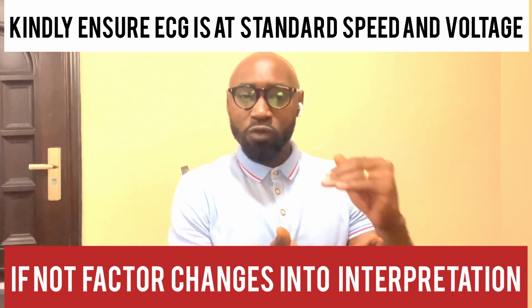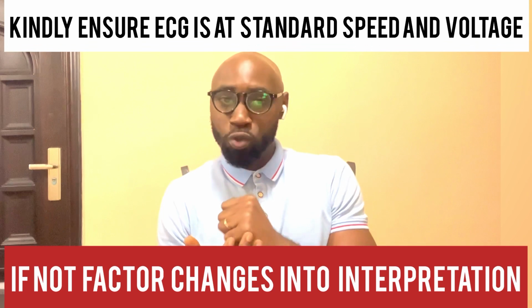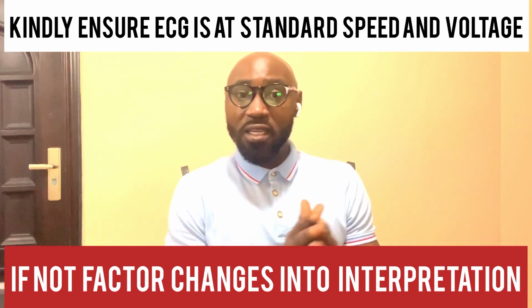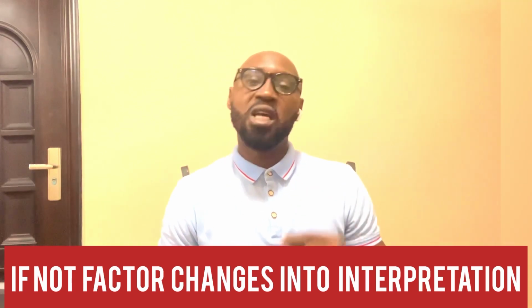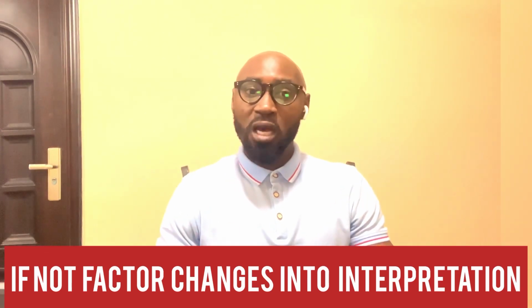That is a standard of 25 millimeters per second and 10 millimeters being equal to 1 millivolt on the vertical axis. If we are not reading at these standards, then the interpretation that we are giving to our ECGs should consider whatever standards or changes that we have made in terms of the settings on the ECG.